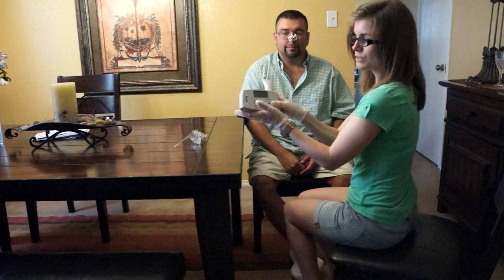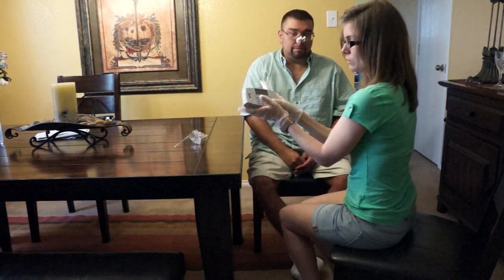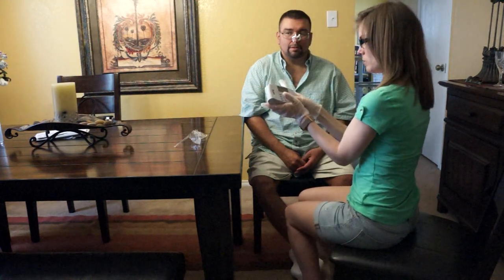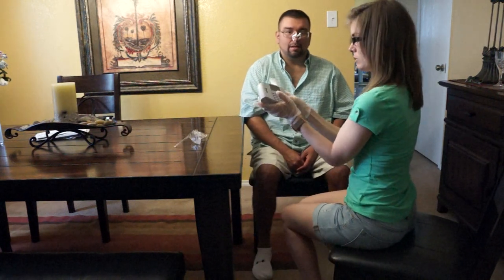Okay, then it's going to ask you to block the spirette before you start until prompted to blast out. Do you have your nose clips on nice and tight? Uncross your legs for me. Thank you.